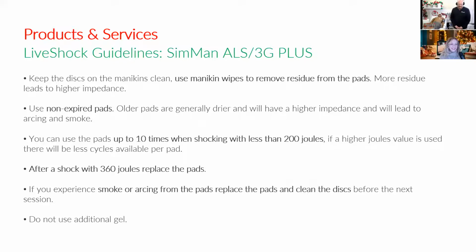Well, I guess the manufacturer has put in the right amount of gel, the science, the chemistry, the physics of defibrillation, and they put in that right amount of gel. And I just wouldn't want to put in more gel and then that gel to be spreading out past the adhesive edges and then allowing for an arc to escape as well. And it just really makes a big mess. So yeah, I would never go with extra gel for sure.